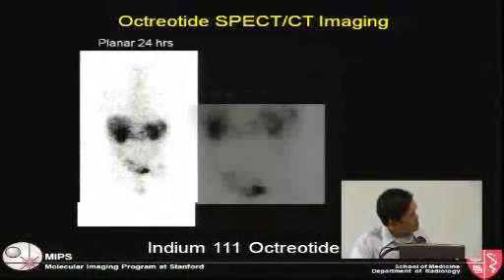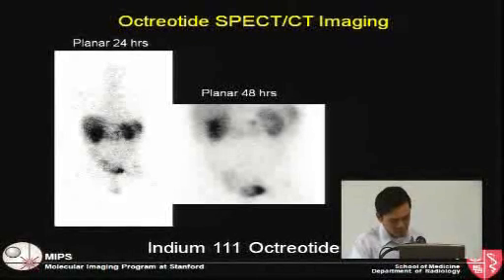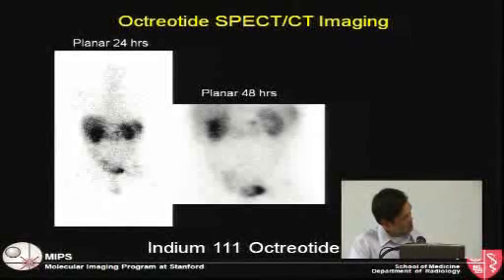So to delve into a little more detail, this scan requires us to inject a patient on day one, and come back on day two to get imaging. If we can't resolve little spots like this on day two, we actually go to day three and see if that spot stands out even more. In fact, in this particular case, that spot does stand out a little more.